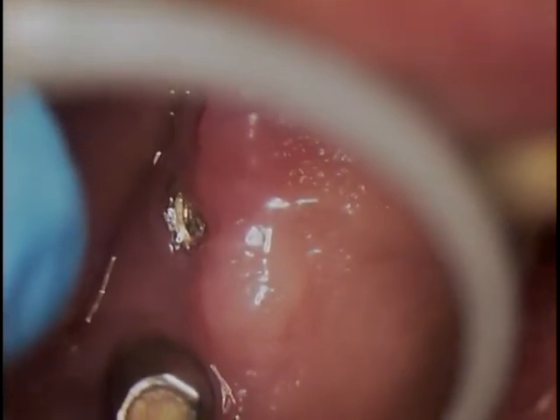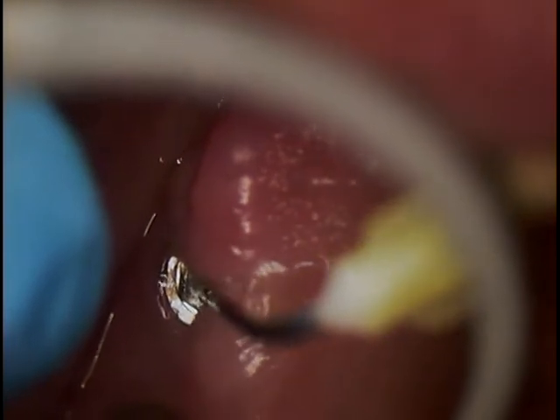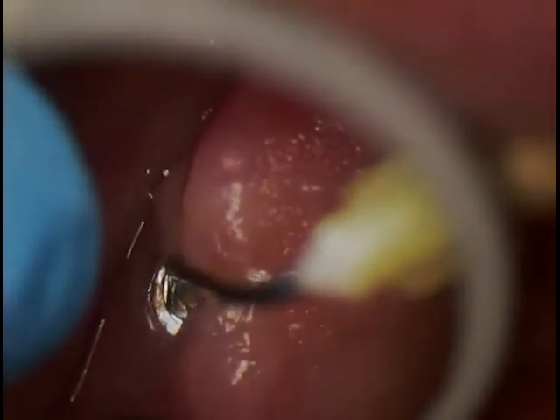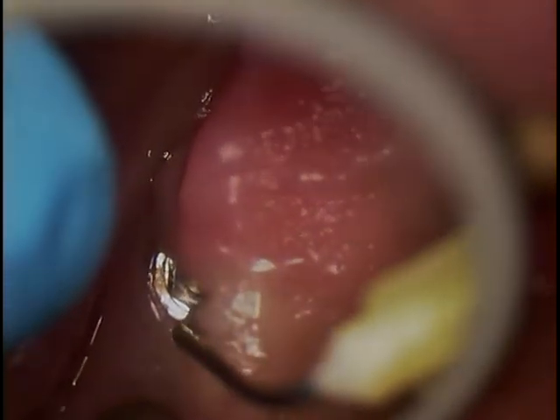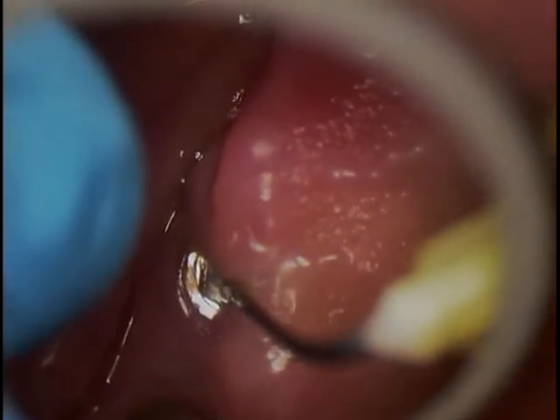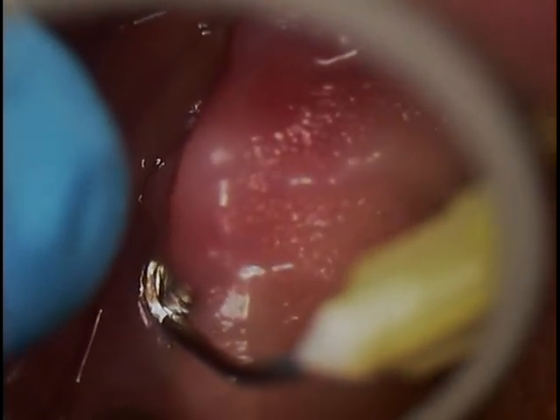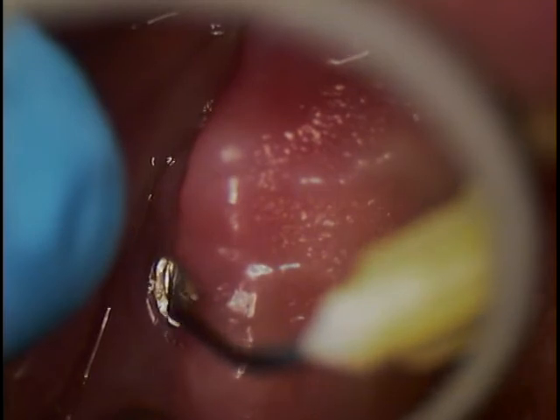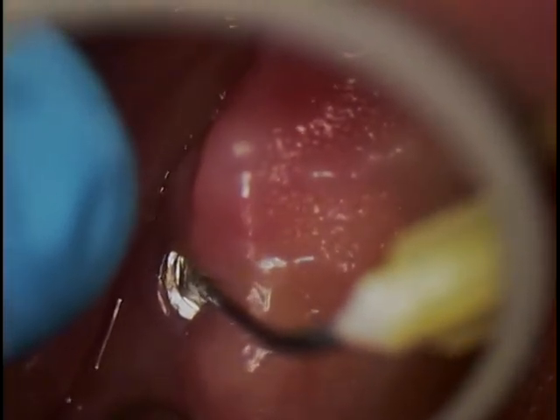I'm going to use micro suction now and just go ahead and suction that up and view the top. It is an external hex, and definitely there was prior access. You can see the burn marks in there, and a lot of the actual vertical length of the hex itself is now reduced.